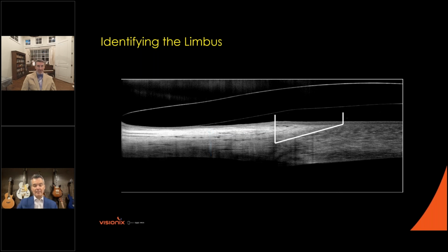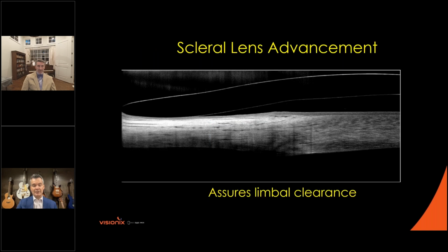So here's the cool thing about the technologies that we're fitting nowadays: they've just changed so much. Most of the contemporary scleral lens companies have actually created limbal lift zones or regions that lift up away from the limbal region in a very strategic way. What I've highlighted here with the first yellow arrow is the landing zone of the lens.